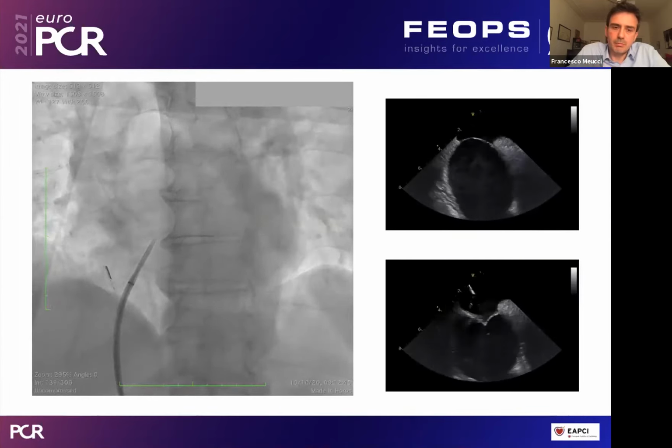So you have seen the transeptal, and you see very nice monitoring of the transeptal puncture of this procedure by ICE. This is the way I cross the septum with the ICE probe. So doing a little bit of hole going back and forth with the introducer of the flex device. I generally put 2 wires, and in the RAO projection, I direct the probe of ICE in the middle of the 2 wires, crossing the septum.